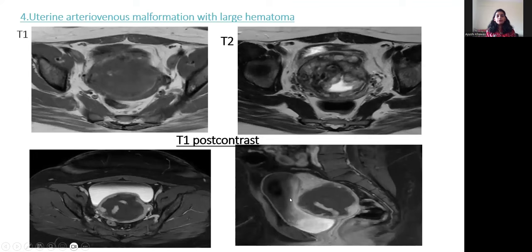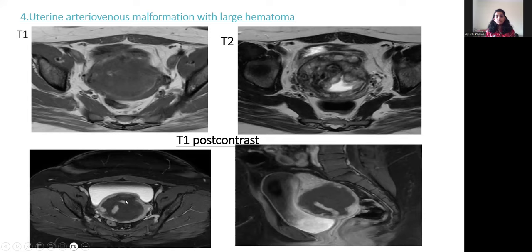Fourth case: uterine AV malformation with a large hematoma. T1-weighted MRI shows a large hypointense mass in the uterus with few flow voids. T2-weighted MRI shows multiple flow voids with a heterogeneous mass in the uterus. T1 post-contrast image shows a non-enhancing hematoma with multiple flow voids and multiple vascular channels crossing the mass.